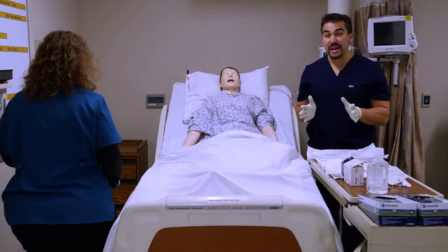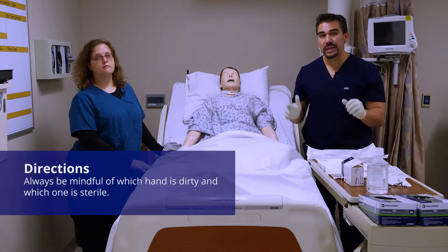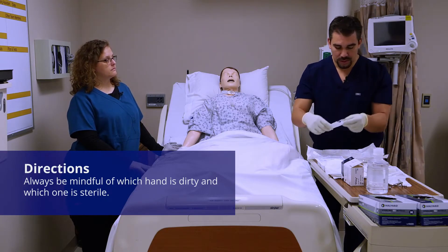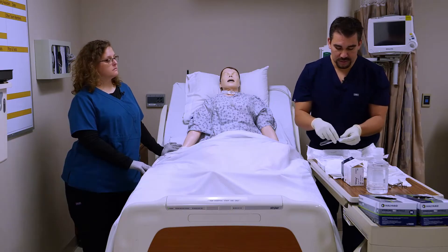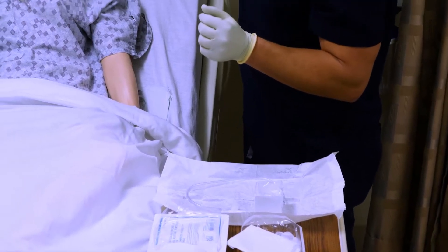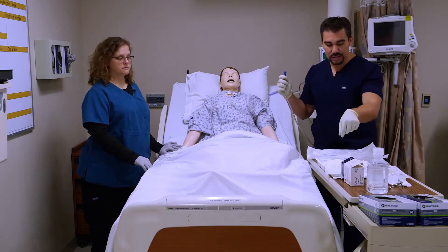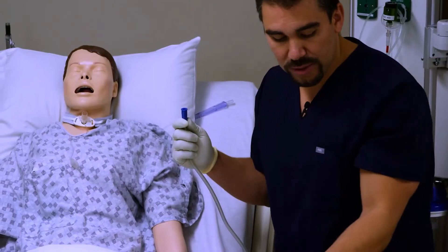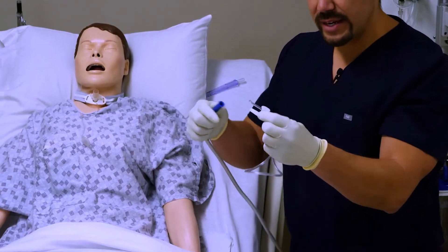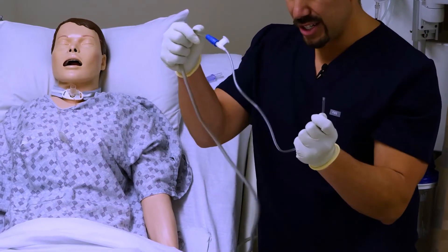The next big step is to set up your suction device. Really the trickiest part is knowing which hand is clean and which hand is dirty. I'm going to set up my 14 French here and put it in my sterile field, then grab my suction device. So now this hand is dirty. Disconnect the old suction and apply the new 14 French here. Make sure you get a full fistful because when you're putting it in, you want to make sure you know which hand is clean and which hand is dirty.